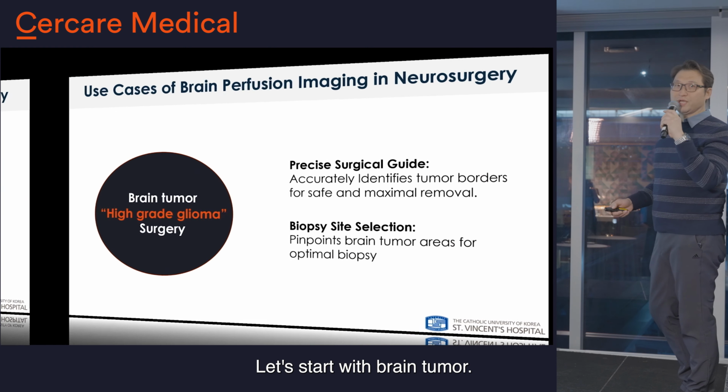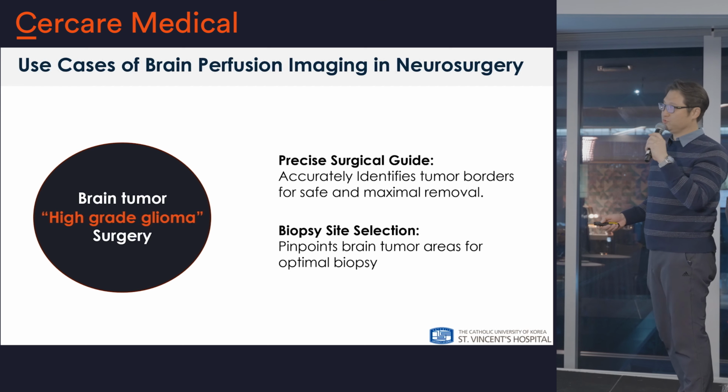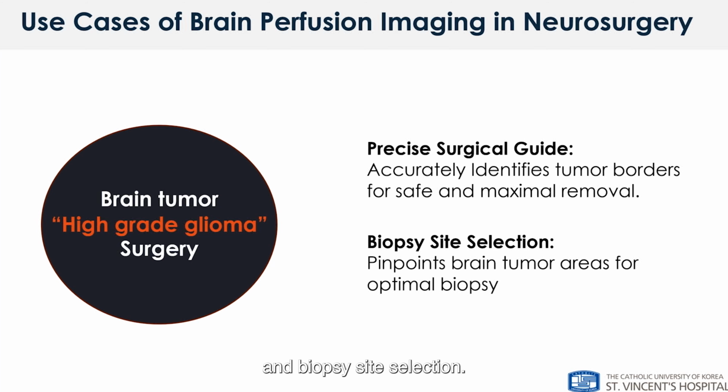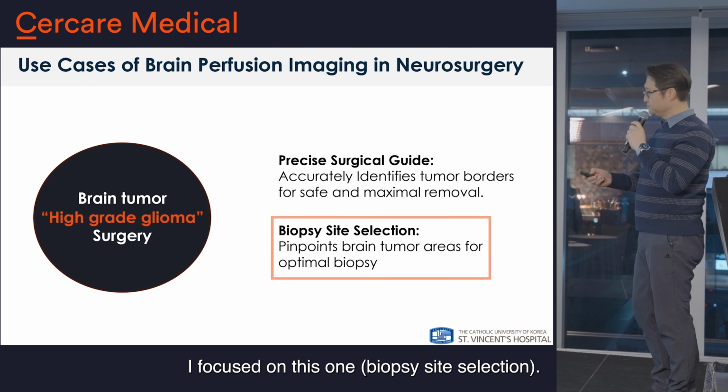Let's dive into brain tumor, especially high-grade glioma surgery. There are two main themes of this: precise surgical guide and biopsy site selection. I focused on this one.